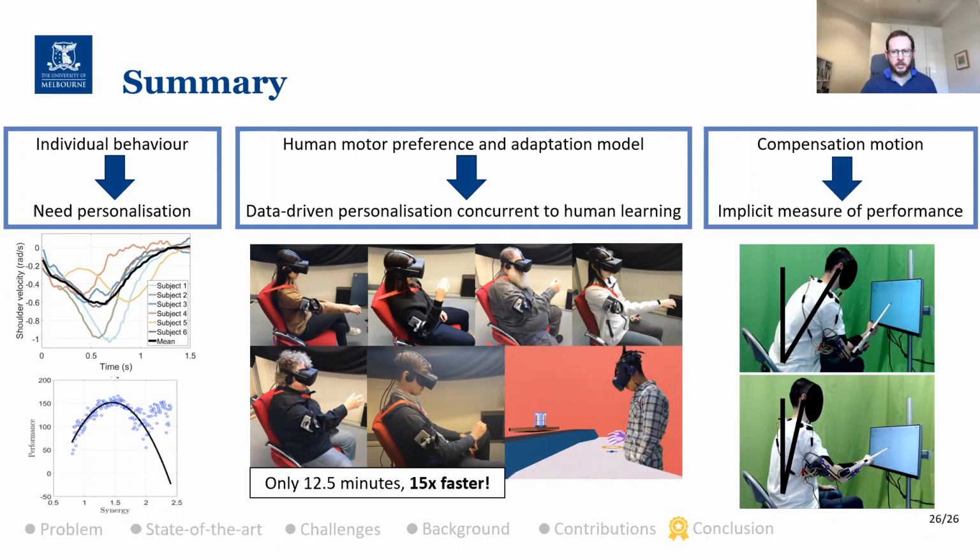And another question, so you have this oscillation to converge. Do you think if this kind of system is used, if somebody is wearing a prosthetic, you would run that for a little while and then freeze the synergy values, or would you just let it keep running with a small dither and maybe it changes slowly over time?